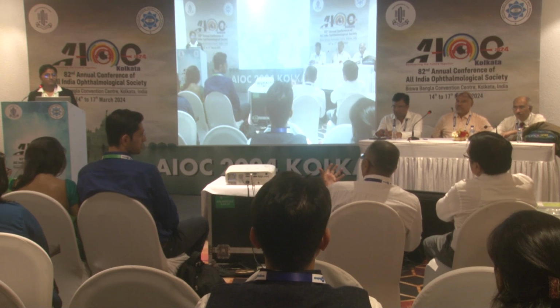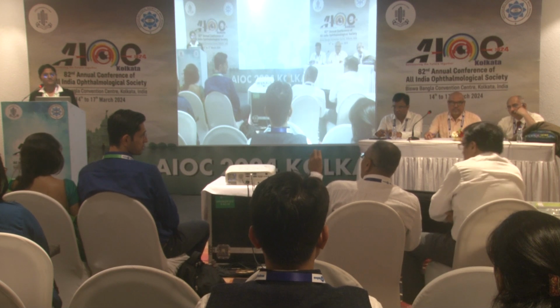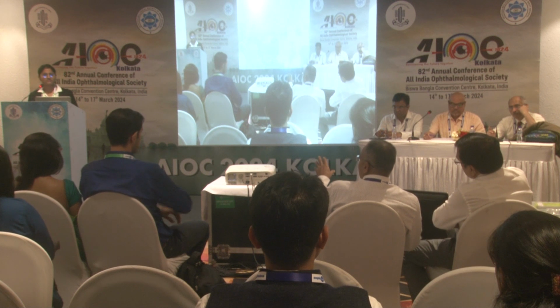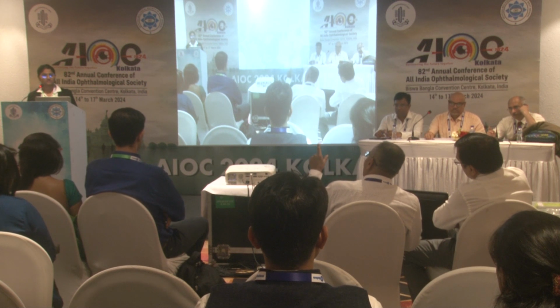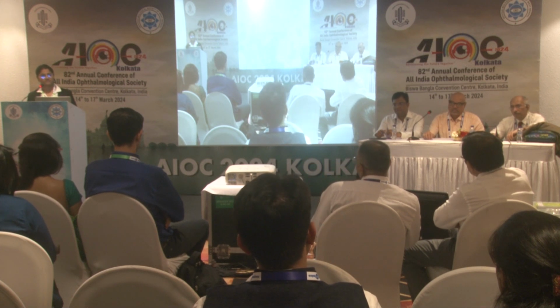Okay, what I do, I have a CandyCam app with me, which has a continuous flashlight. But the cameras now have 3-4 lenses to capture photographs. It is very difficult to find which lens is the best lens to capture those images. Yes. So the initial phones which had only one camera, with the flashlight quite near to it, were very useful in taking those photographs. Now it is very cumbersome and very time-taking.